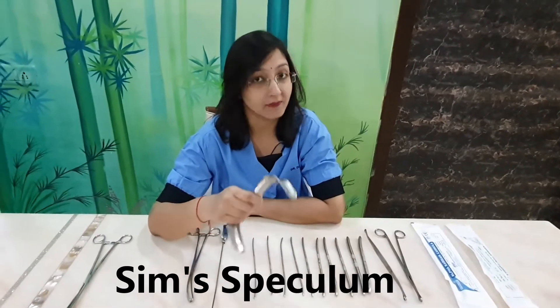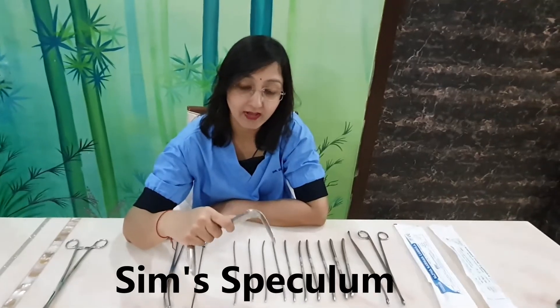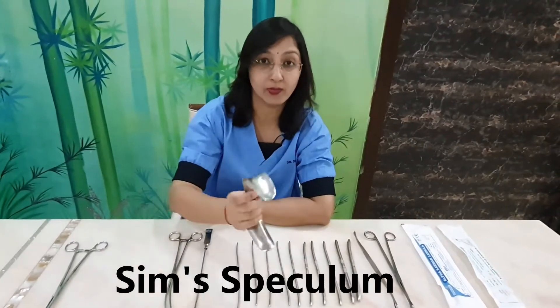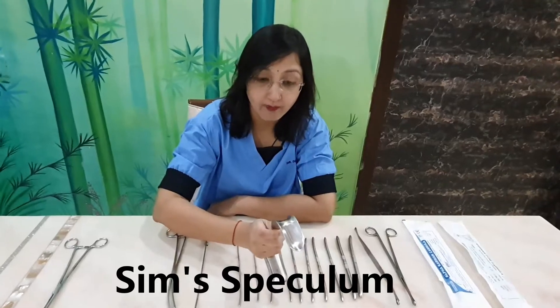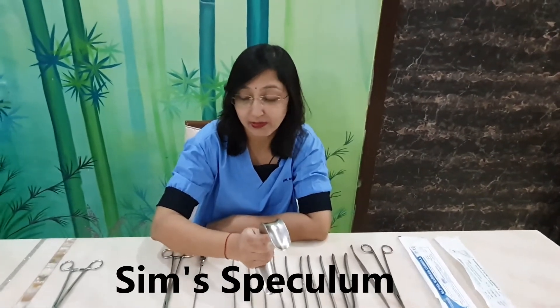After painting, we insert the Sims speculum into the vagina, rotate it 90 degrees, and depress the posterior vaginal wall. After depressing the posterior vaginal wall with the Sims speculum, we move to the next instrument: the valsellum.